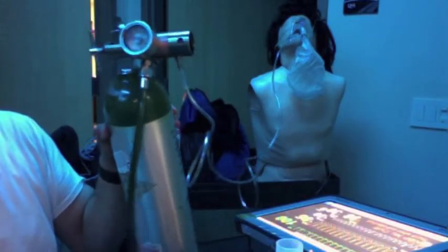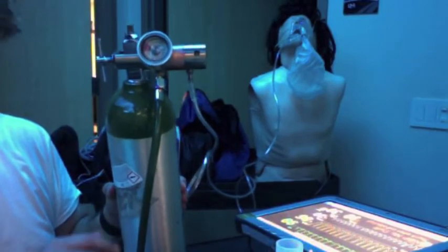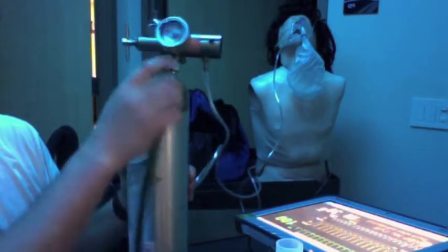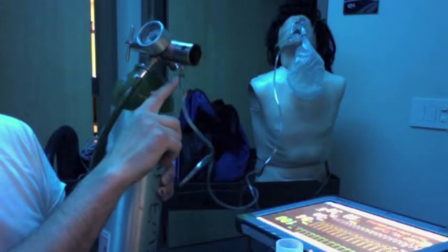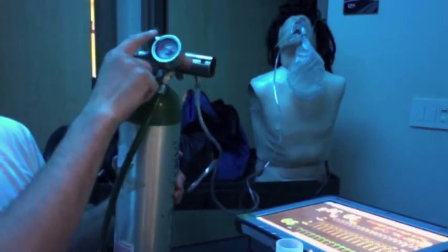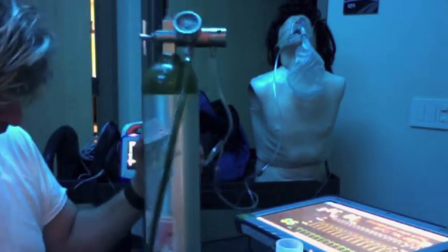Okay, so setting up the CPAP, just remember there's 20 different brands out there. The ones we have here in the building usually require you to hook up your green cable to the threaded adapter here. You can still use your oxygen port. However, to power the oxygen port means you have to have the bottle on. As soon as you turn the bottle on, you are powering your CPAP.